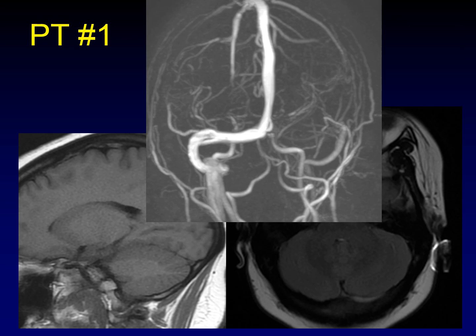These two patients looked identical on MRI. They had the same abnormality on FLAIR, the same lack of flow void on T1, and the same lack of flow on MR venography. But one of them had slow flow in a patent sinus, and the other had an acute dural venous sinus thrombosis. This is the problem with MRI — it can't tell the difference between slow flow and acute thrombus, and this is why CT venography is better in this diagnosis.